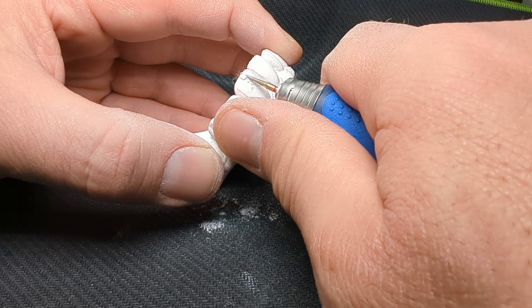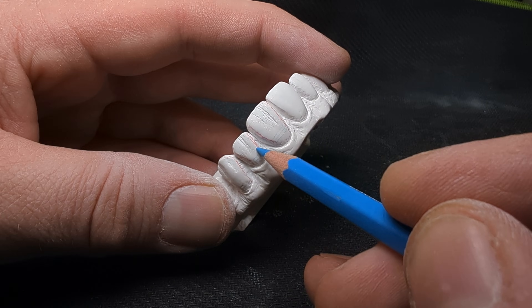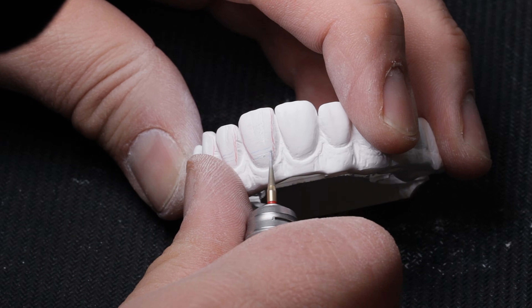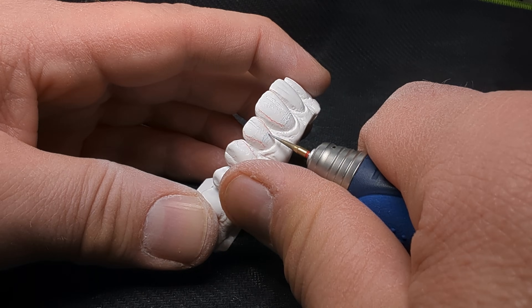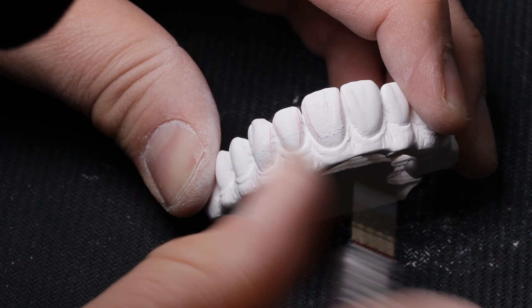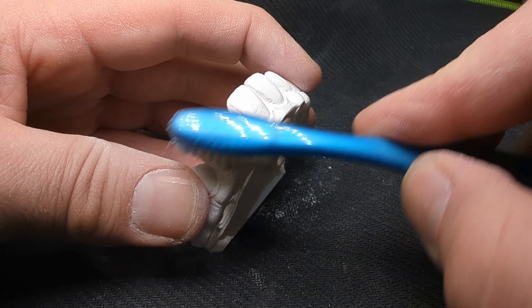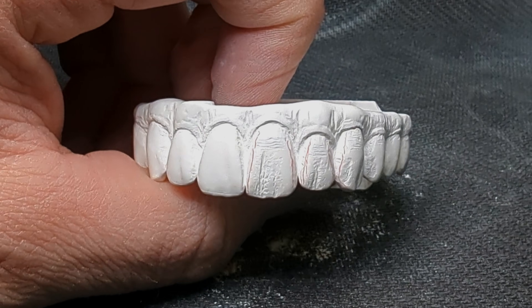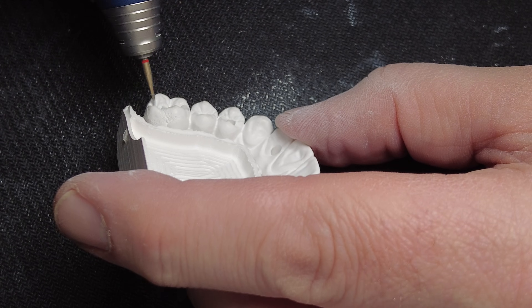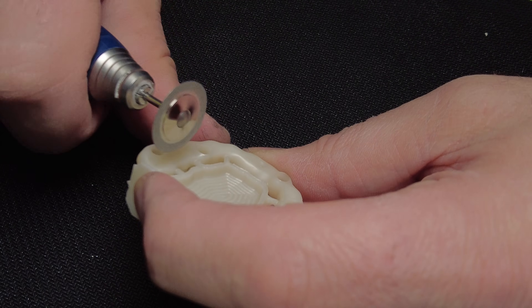The fine texture on the surface of a crown and every attention to detail will make your work stand out. The tricky part in zirconia green stage contouring is to imagine how it will look after sintering with a layer of Mio and glaze paste on the surface. Don't be shy to over-accentuate the detail and learn from your mistakes. I like to draw guidelines for grinding on the zirconia to visualize the texture, which makes it more symmetrical. Always use a clean toothbrush to clean the dust from the surface to avoid wide pits in the sintered zirconia.